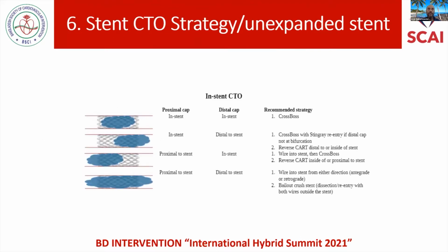Different microcatheter, sometimes using a shorter microcatheter works. Sometimes, again, we don't use this so much anymore, but you might want to use a wire with a slightly different body. If that doesn't work, you might essentially want to give up on the collateral and go to a different collateral, or use a retrograde wire as a marker and come antegrade.